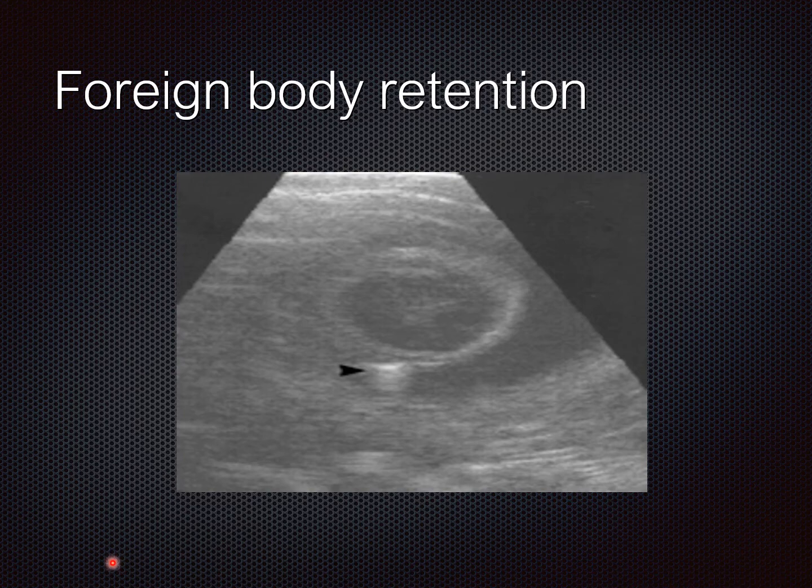Now, if you were to accidentally ultrasound someone for a foreign body, this would basically be what you were looking for. So in the anechoic posterior chamber of the eye, a bright white linear structure, same as a foreign body anywhere else.